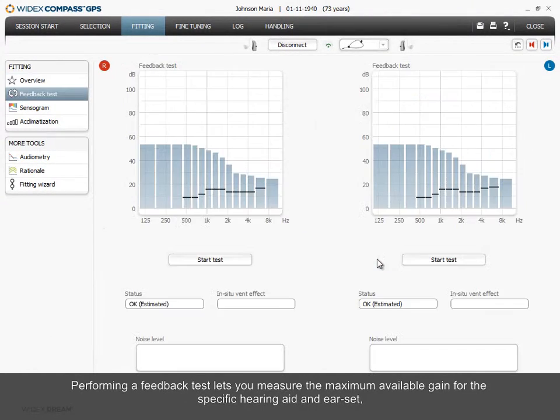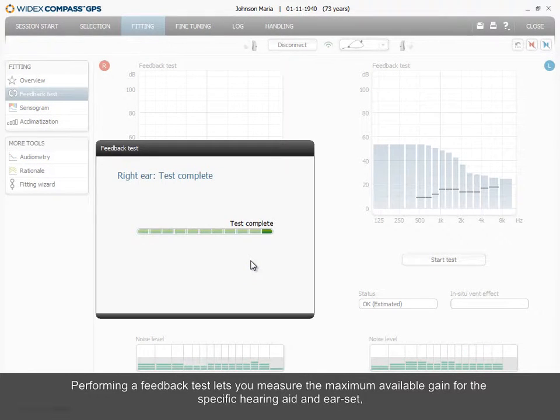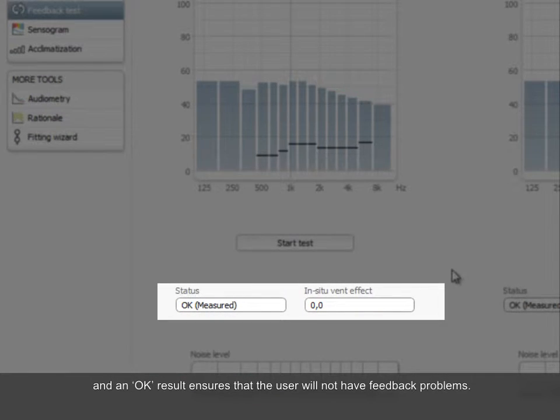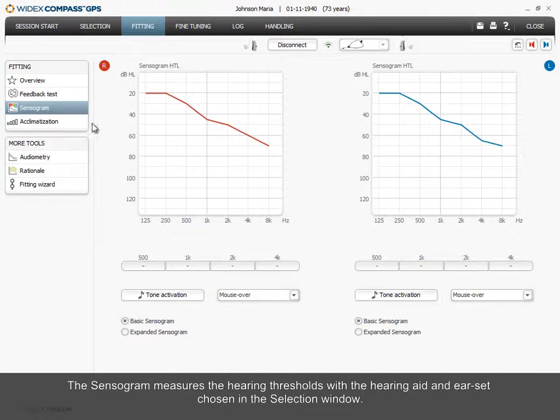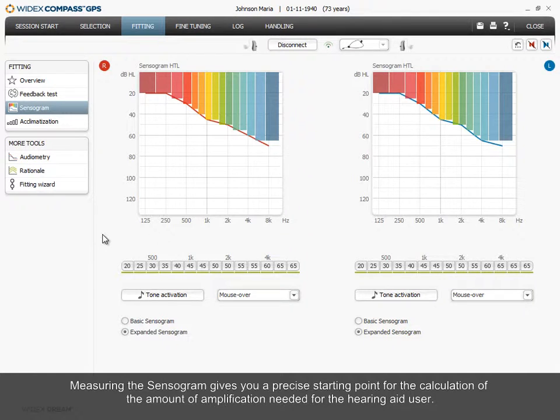Performing a feedback test lets you measure the maximum available gain for the specific hearing aid and ear set, and an OK result ensures that the user will not have feedback problems. The Sensogram measures the hearing thresholds with the hearing aid and ear set chosen in the selection window, giving you a precise starting point for the calculation of the amount of amplification needed for the hearing aid user.